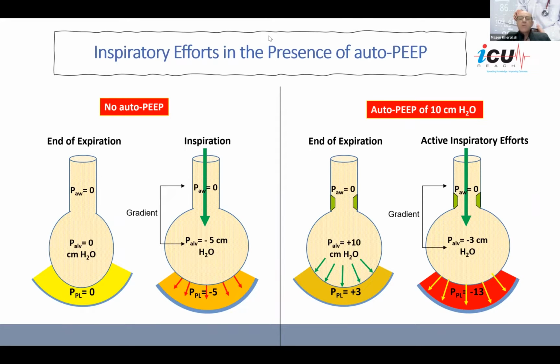Okay. In modern ventilators, is the difference between flow and pressure triggering just a technical one, or does it make sense to switch to flow triggering in case of auto-PEEP? All right. So now most of the modern ventilators are only set for flow trigger.